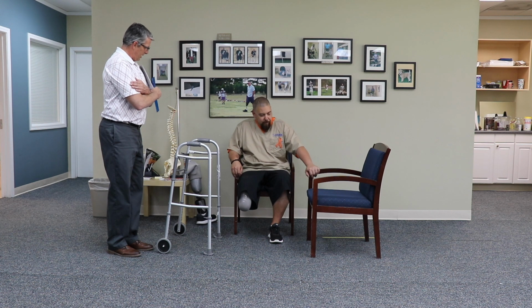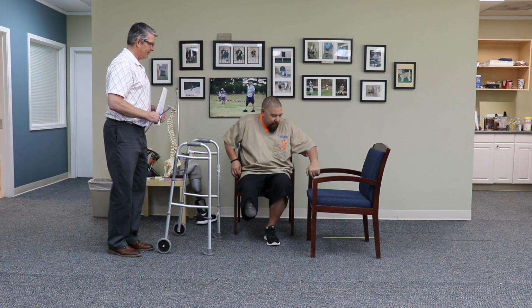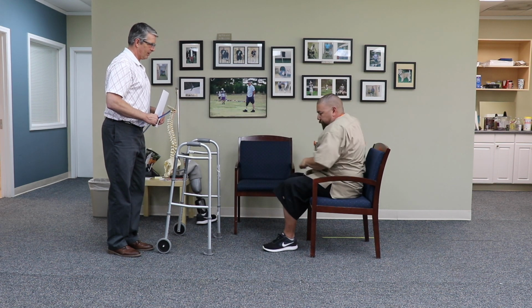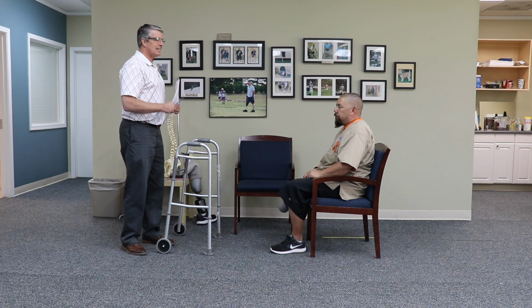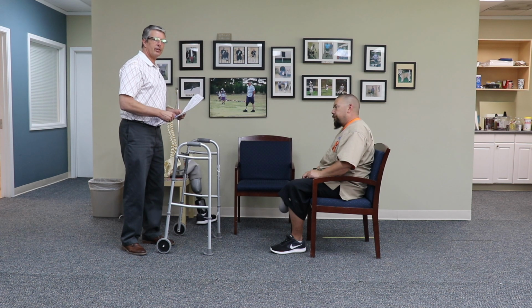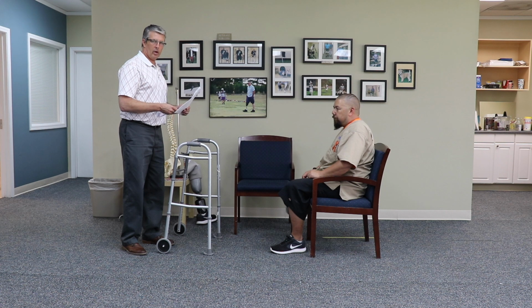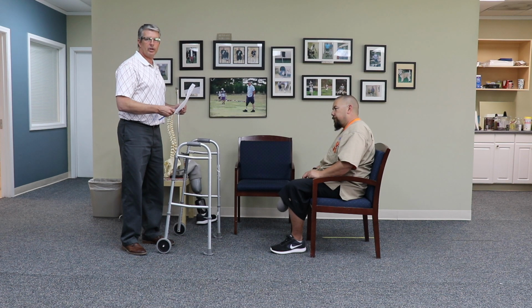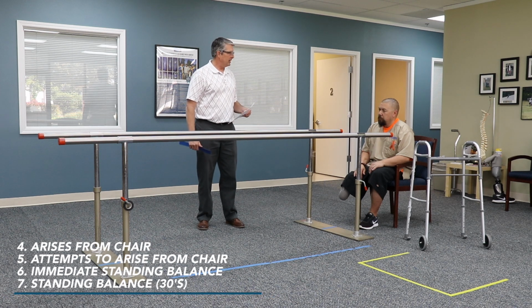Show us one where they might not be so smooth. Okay. So you can see he needed the assistance of the arms of the chairs. Still was able to accomplish it, but with assistance. That would knock him down to a 1. Now if your patient's uncomfortable doing it, or you're uncomfortable as the administrator of the test, then put a 0 and don't do it.